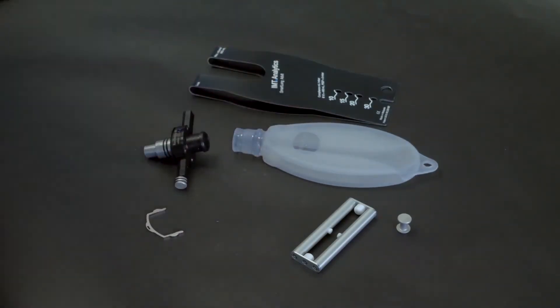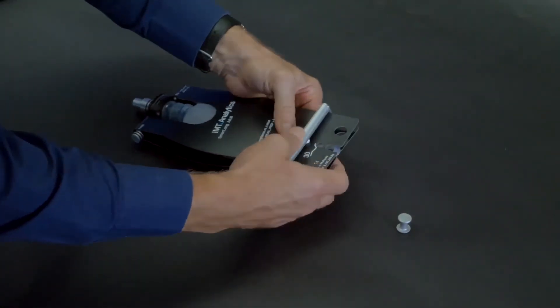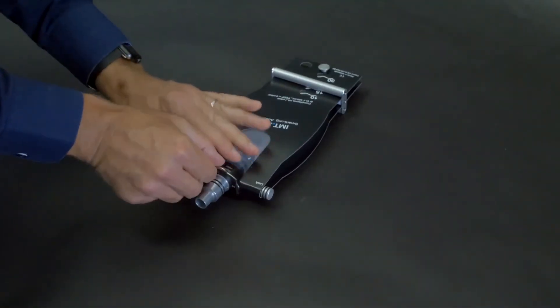The lung is assembled in the reverse order. Finally, push the resistance head forwards and insert the retainer clip.